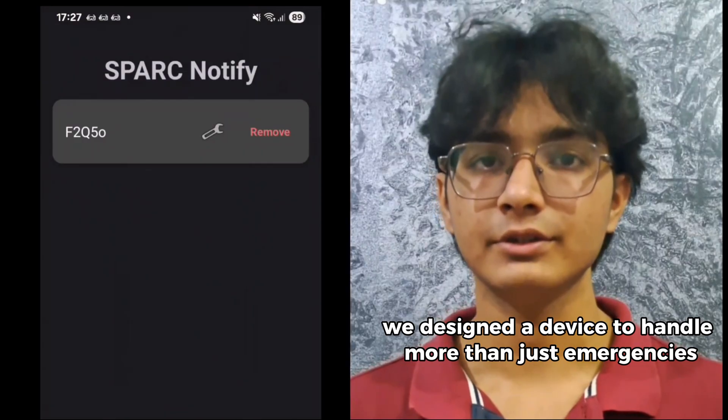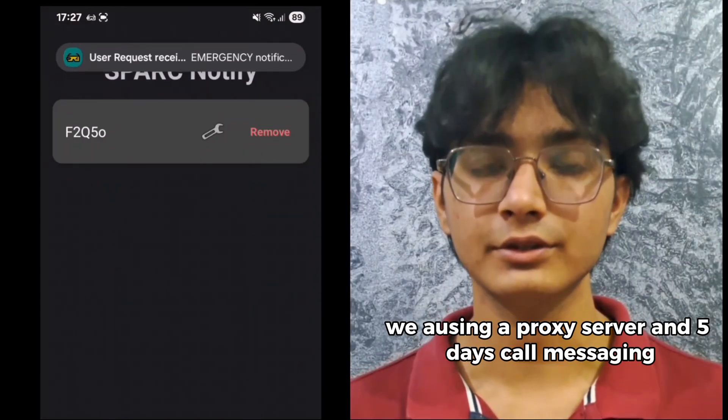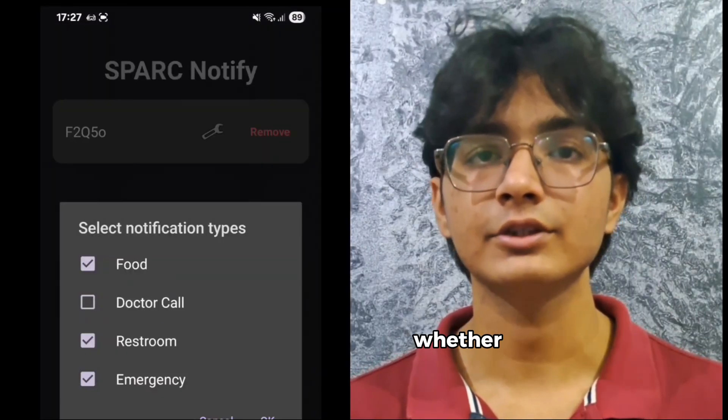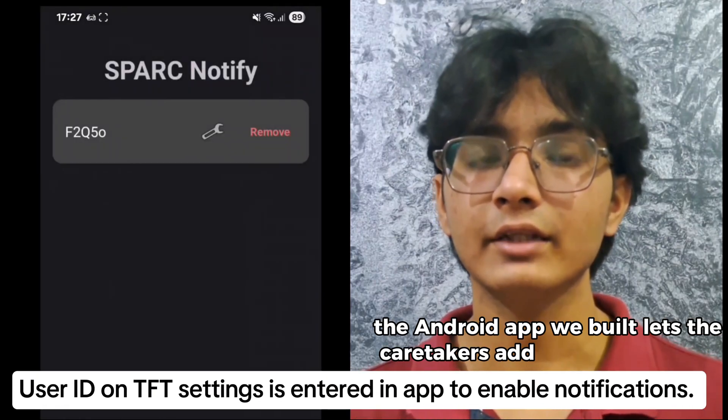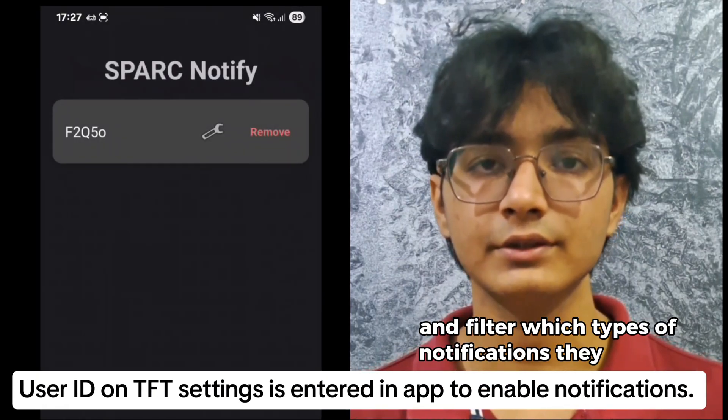We designed a device to handle more than just emergencies. We're using a proxy server and Firebase Cloud Messaging so that the patients can send requests, whether it's for assistance, food, or a phone call, to the caretaker's phone. The Android app we built lets the caretakers add multiple patients and filter which types of notifications they receive.